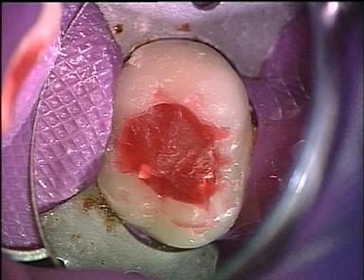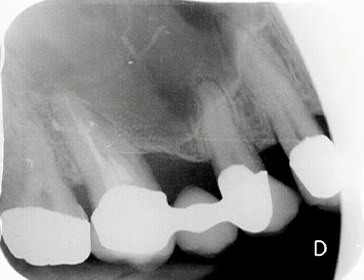The crown cavity is filled with composite and polymerized in layers. The situation at the end of treatment.